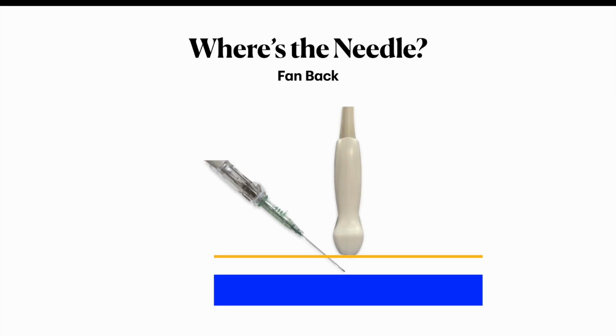Essentially, the goal of this technique is to make the needle more perpendicular to the probe. So you can imagine if we advance the probe slightly and then fan back, we can make the needle more perpendicular to the probe, which will increase our chances of visualizing the needle.